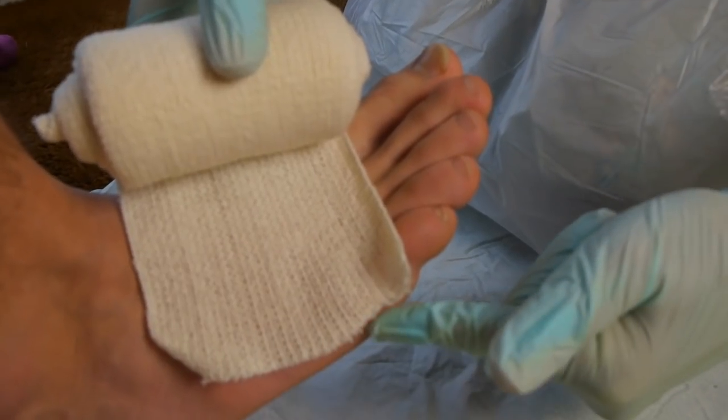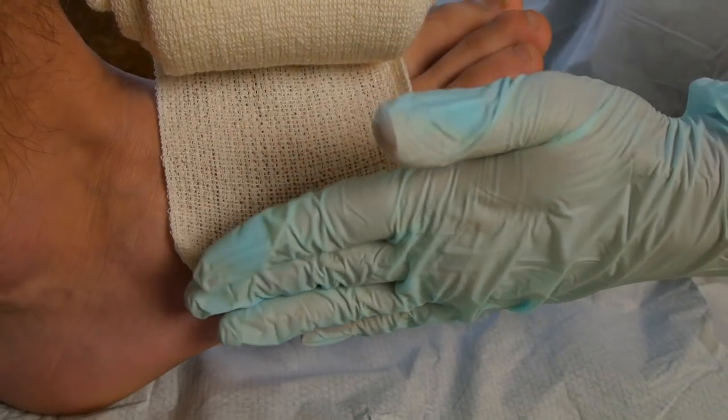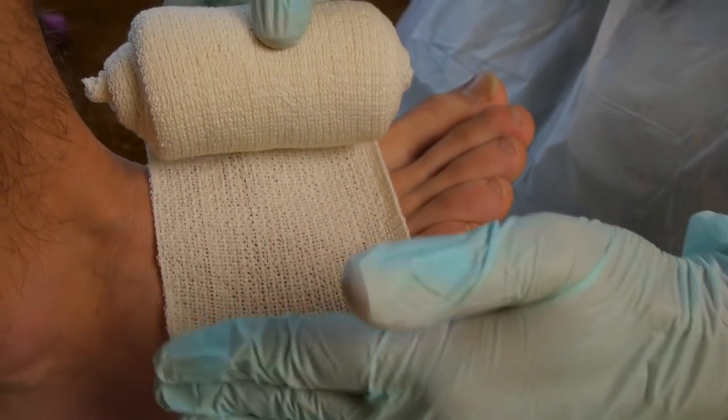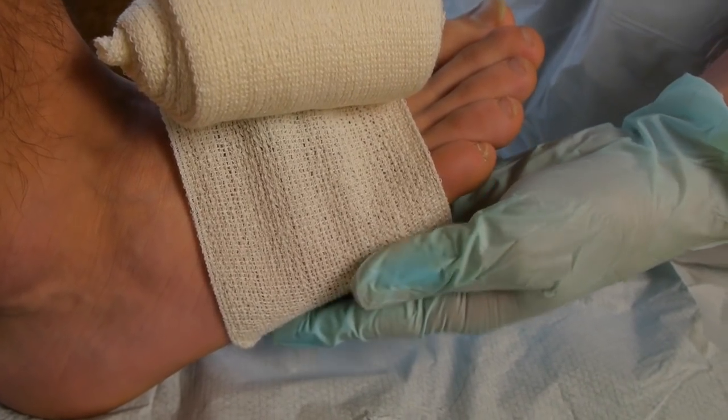Initiate by placing the end of the bandage along the side of the foot. This is for patient comfort. If it was on the bottom, there can be some unevenness that can be uncomfortable.